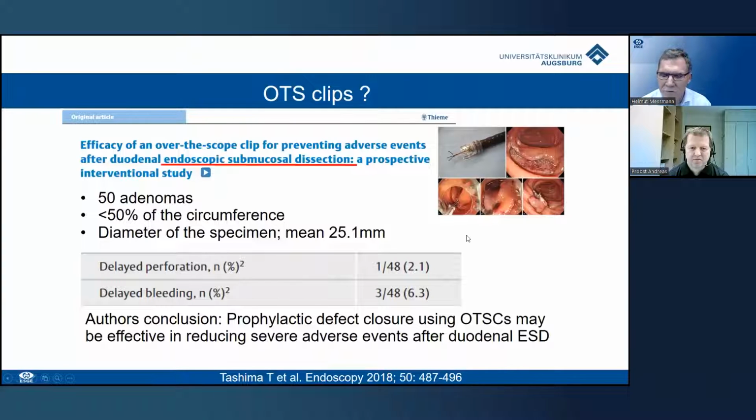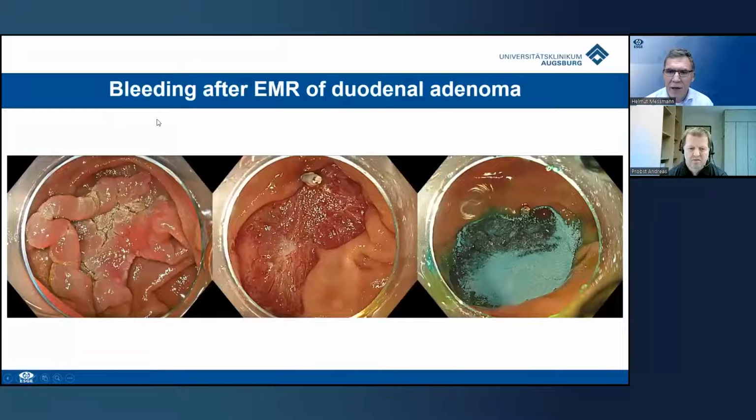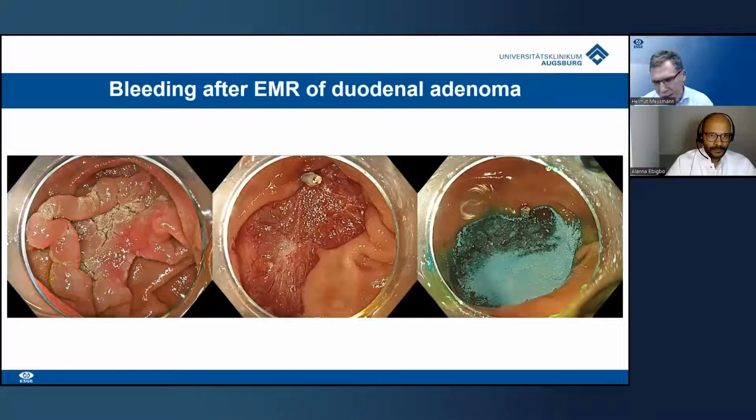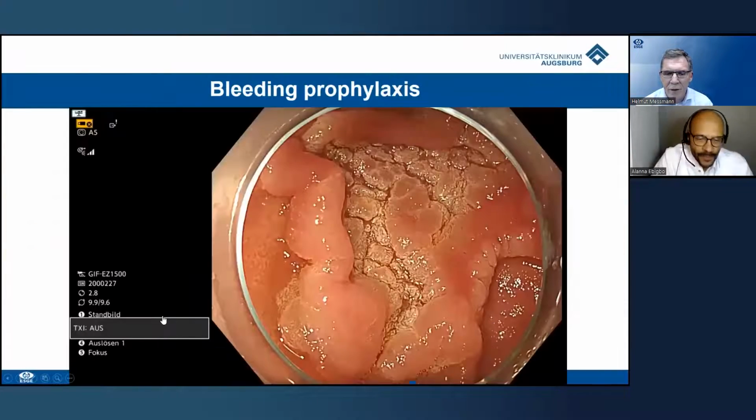Okay. Thank you, Dr. Probst, for presenting our data and the way how to prevent bleeding. Another topic to prevent bleeding may be topical agents. Dr. Ebigbo, I think you can present the next slides. This is a case which was performed by you, and there is a small video. Maybe you can comment on this.